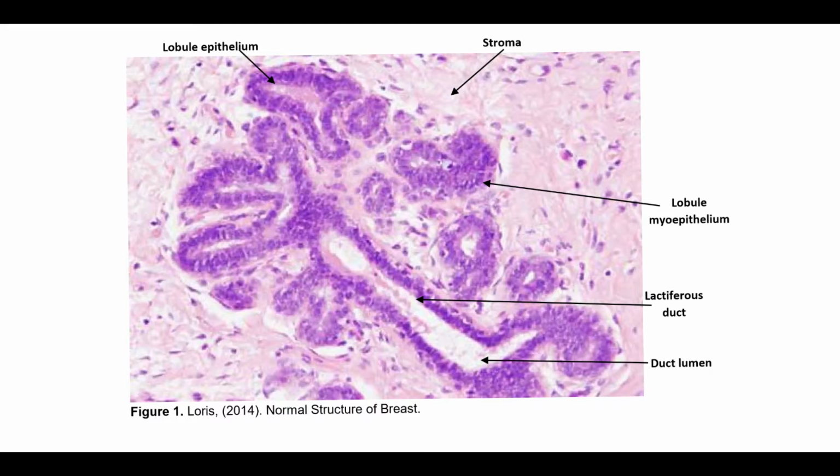The lactiferous ducts are also distinctive from the stromal tissue, which are composed of epithelial and myoepithelial cells. The stroma consists of adipose and fibrous tissue. The ducts and the lobules are jointly supported by a basement membrane separating them from the stroma.